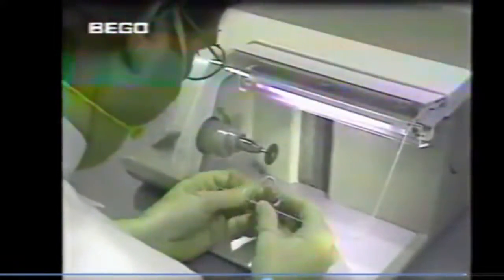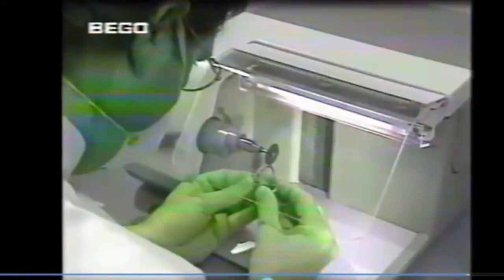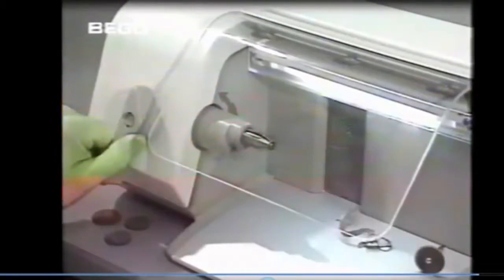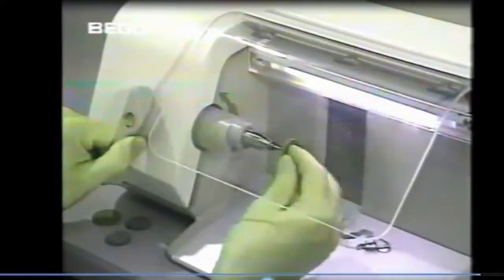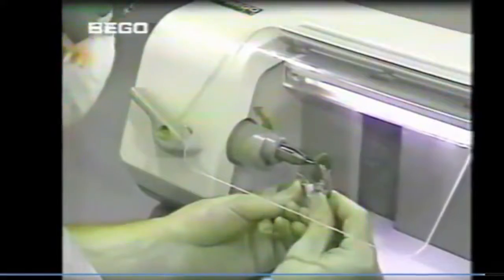The sprues are separated safely and faster on the high-speed grinder with built-in extraction system. Here, small separating discs with a diameter of 25 mm and a thickness of 0.5 mm are used. Once the chuck has been released, the tool can be changed quickly without having to switch the motor off. The fixing points of the sprues are ground with a perforated disc.